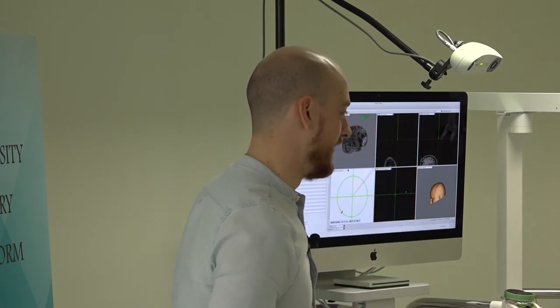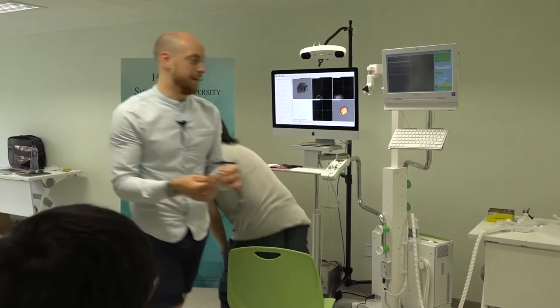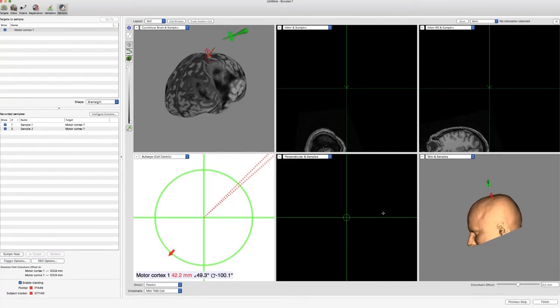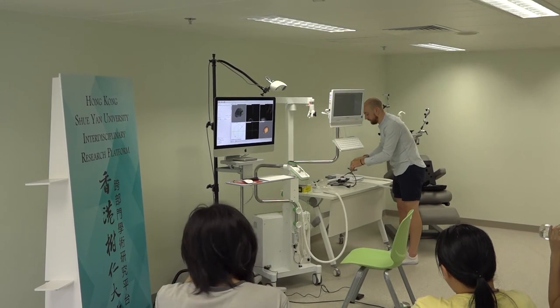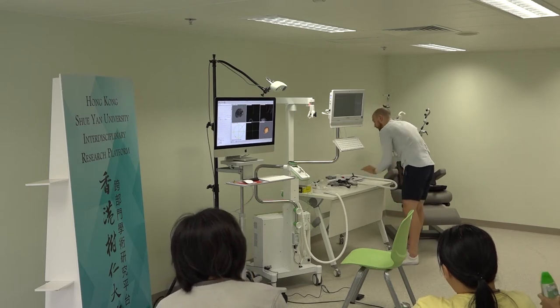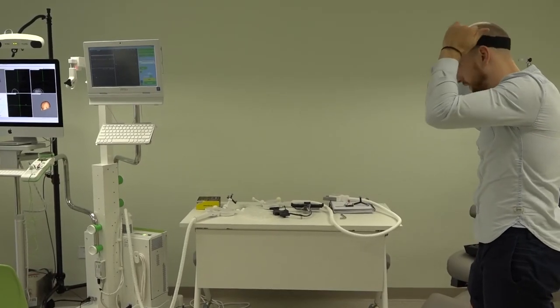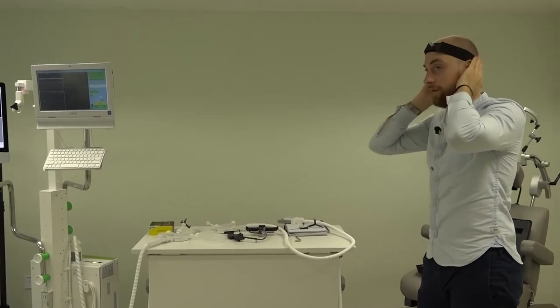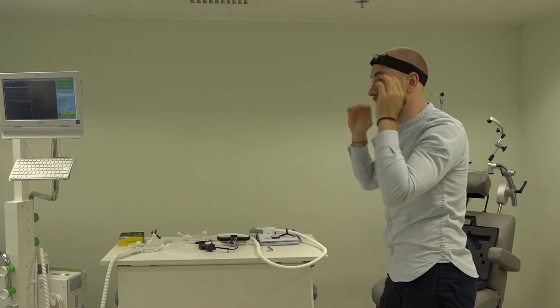So you can take those off if you like. If you've got the glasses on there, another thing we can do is take those off and have the subject wearing the headband instead. This can be a bit more comfortable. So we've got a headband on there, and we've got the subject tracker just there. It means that there isn't anything resting on the face at all.